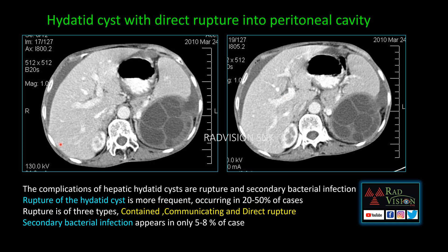In another case, you can see a hydatid cyst with multiple daughter cysts, with a breach in the wall of the hydatid cyst and expulsion of contents into the peritoneal cavity. This is a case of hydatid cyst with direct rupture into the peritoneal cavity. The complications of hydatid cysts are: rupture of the hydatid cyst and secondary bacterial infection. Rupture is either contained rupture, communicating rupture, or direct rupture.